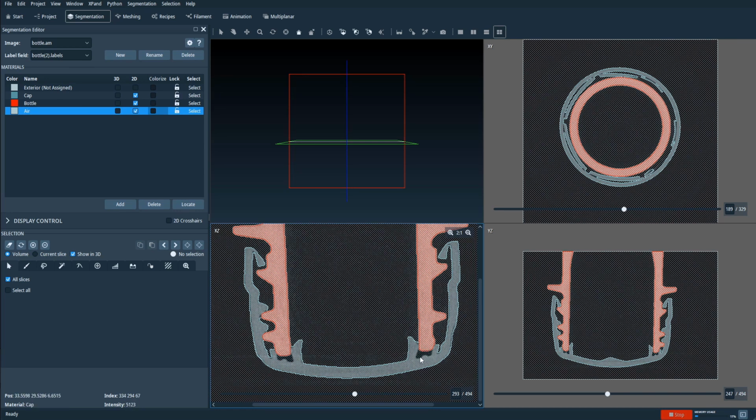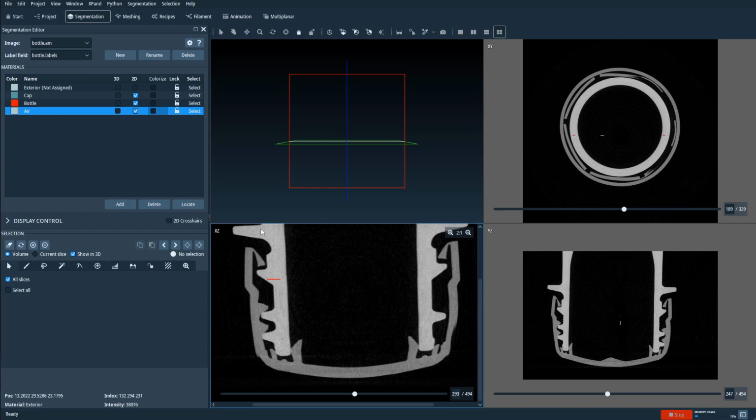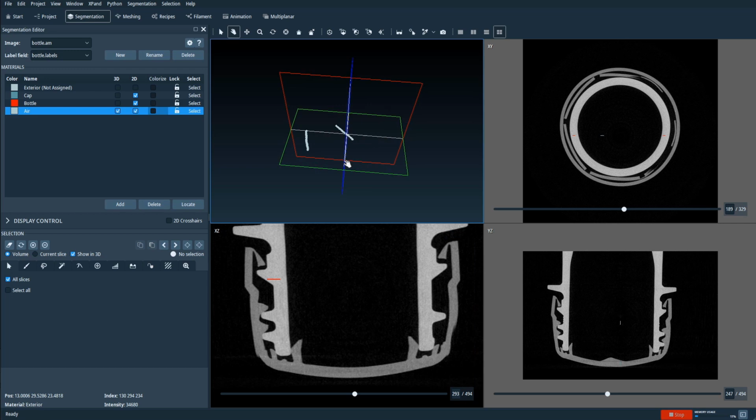This is actually coming from the problem that we provided a very limited number of markers in our initial segmentation, as you can see here. If you look at the markers where we have air, it's just here and here. So these are separated from the region. If you imagine a connected region that you can grow from these markers, this part will be excluded.